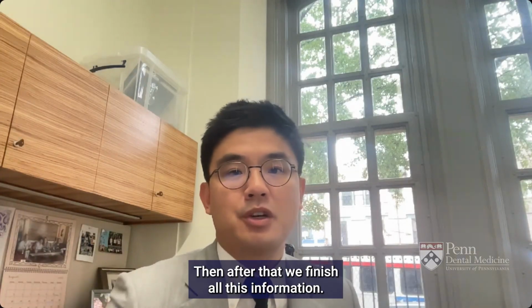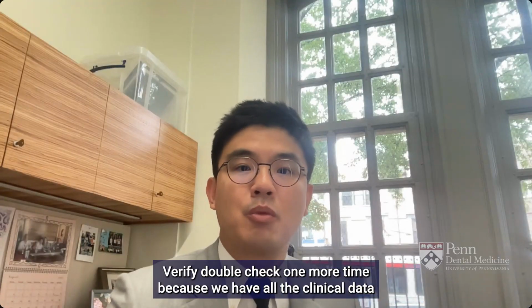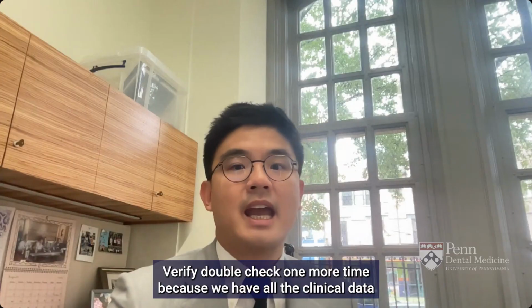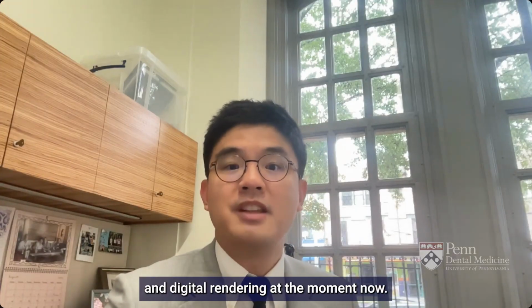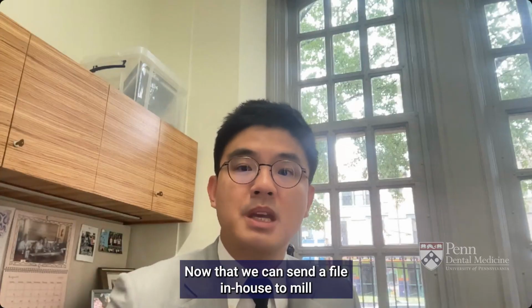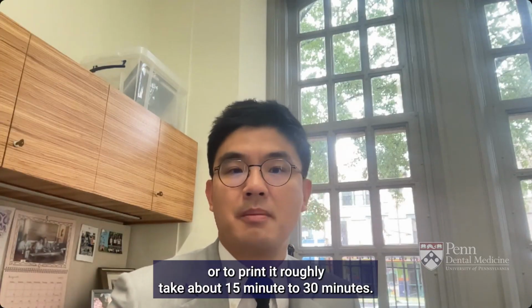Then after we finish all this information, we can merge all the files together, verify, and double check one more time, because we have all the clinical data and digital rendering at this point. Then we can send the file in-house to mill or to print. It roughly takes about 15 to 30 minutes.